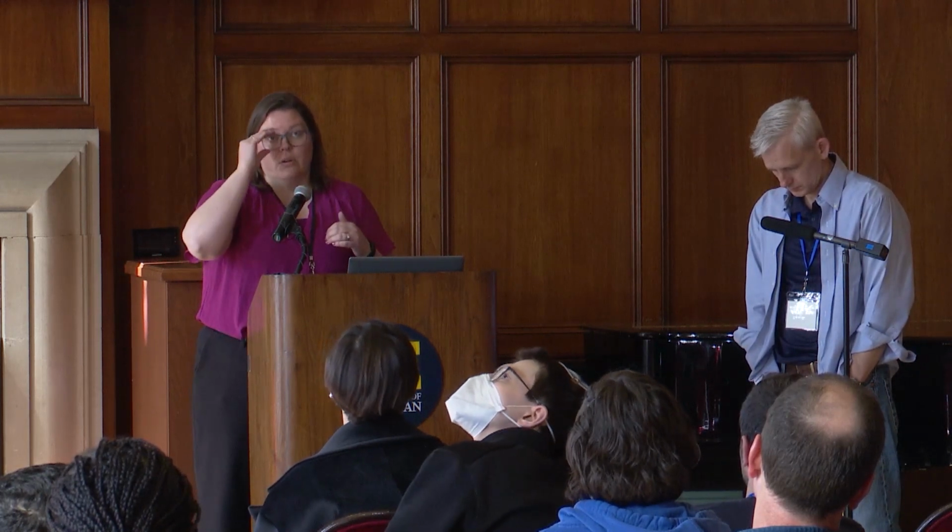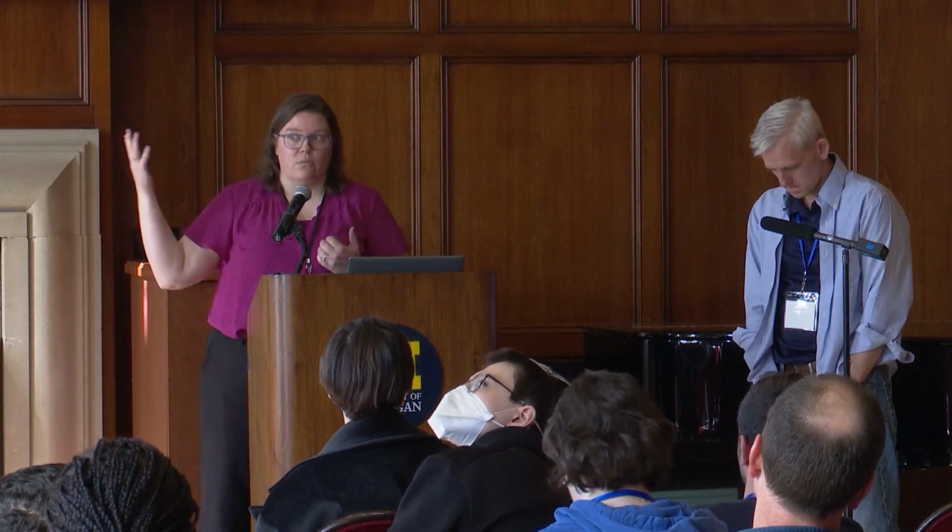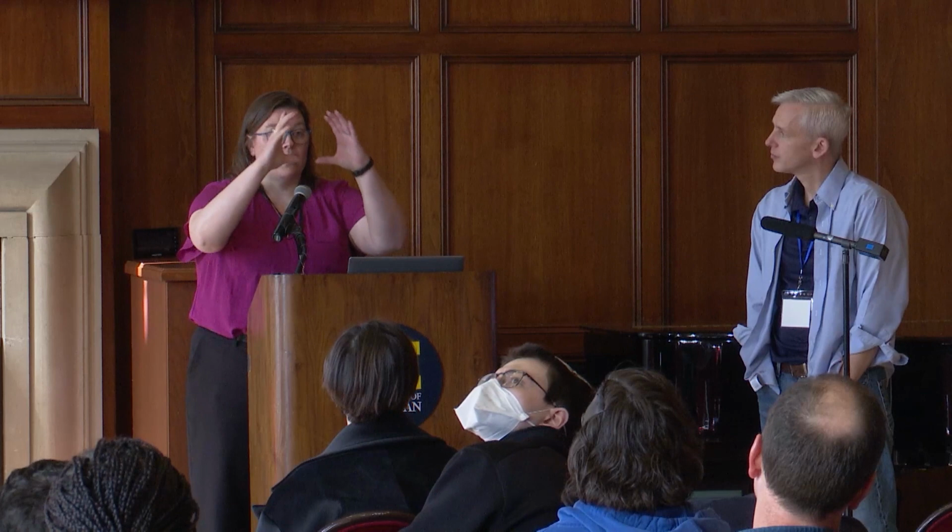We came back to the really strict rules we had made. Going from the outside towards the center, is it still thick? Even if it's not thick, if it's the first bone you encounter, we consider that cortical. When it starts really looking trabecularized, we didn't count it. And one thing that we have too, and I didn't really show examples of it, is that as they're aging, you might have the original cortical boundary, but then you have this bone remodeling over here. Some of that's pathologic, but all of a sudden what was your original cortex that was really thick starts getting remodeled away, and then you have this real thin bone over here. So that was another challenge we had to deal with: in that case where you clearly have almost like two cortical boundaries, how do you deal with that? So strict rules and consistency.